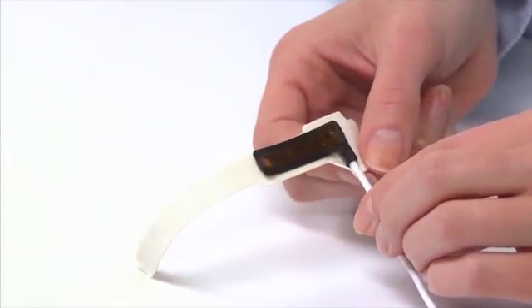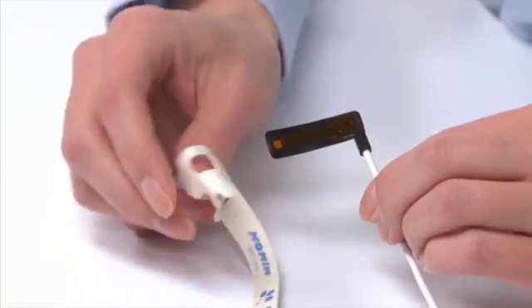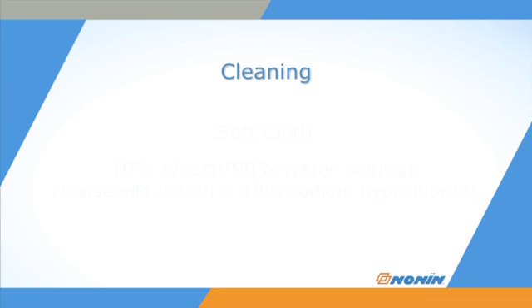Remove the Flex sensor from the FlexiWrap and discard the wrap. The Flex sensor can be cleaned for use with a different patient.